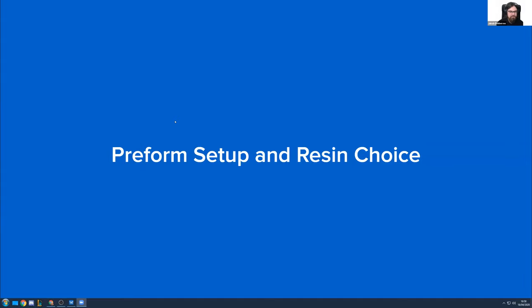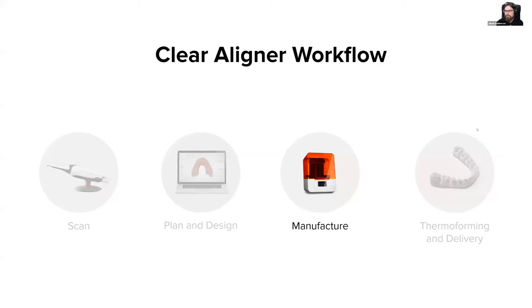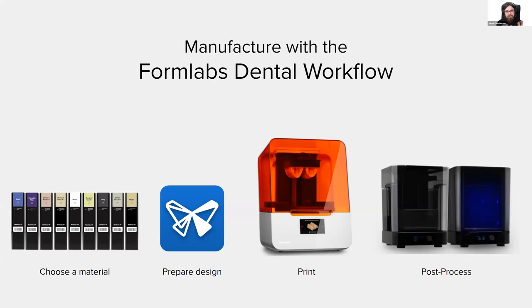Yeah, thank you very much. So we're now going to talk a little bit about the PreForm setup and resin choice. I'm just going to be spending a little bit of time here, as Bernhard will also show you a little bit later. So going back to the complete clear aligner workflow, we're currently in this third step of manufacturing, basically the model for thermoforming on top. And we have segmented this into multiple parts.